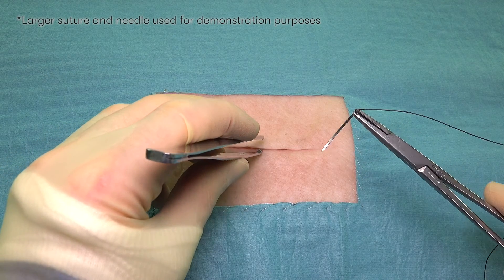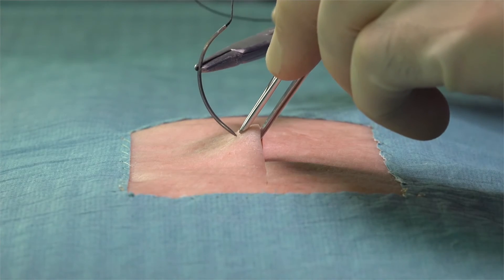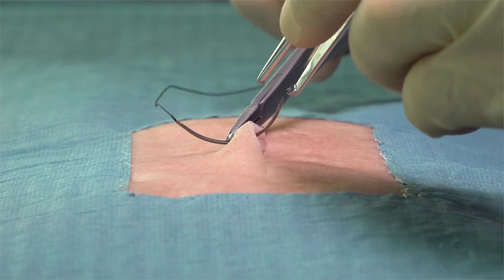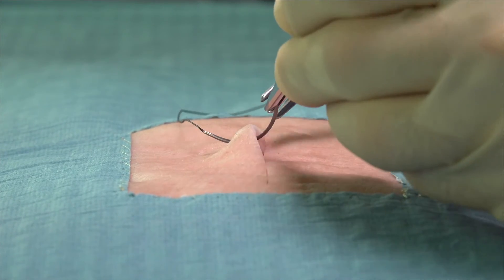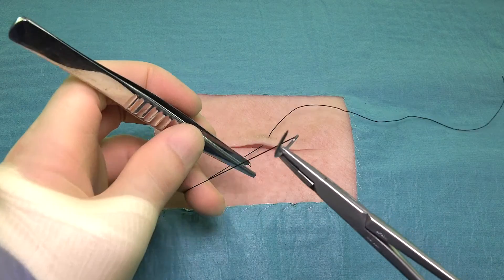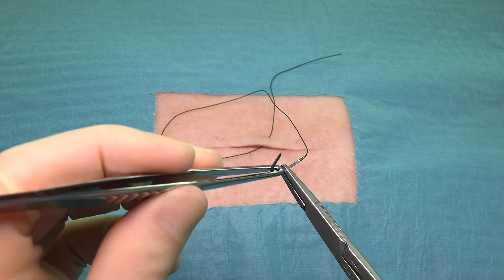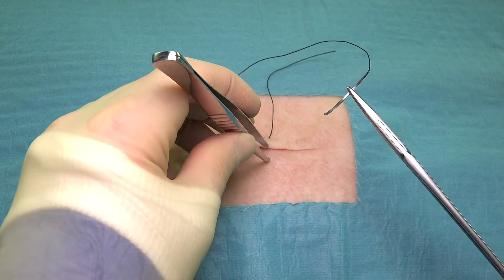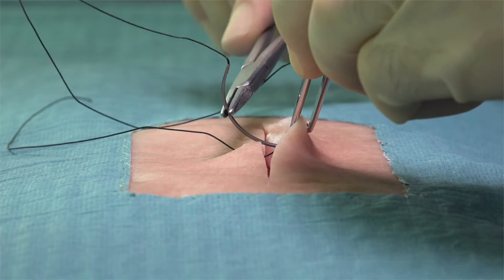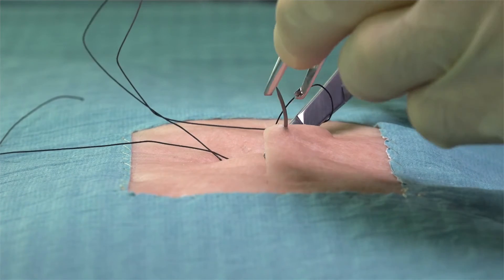We start by picking up the far wound edge with our tooth forceps and inserting the needle at ninety degrees to the skin. We progress the needle by the smooth supination of the wrist. We then reposition the needle and take a second deep bite, aiming to come out on the skin surface approximately the same distance from the wound edge.